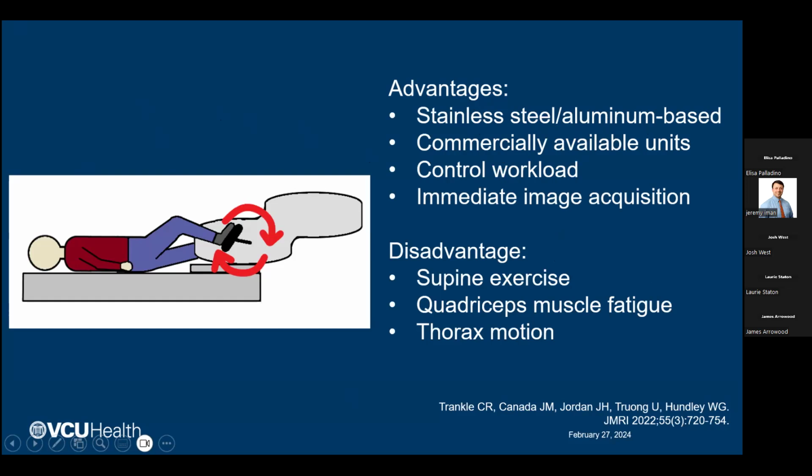It's very sophisticated equipment, but you can control the workload. And so, as with a bicycle unit that we might use in the exercise laboratory traditionally, if the patient pedals at a slightly faster cadence, the resistance eases off. If they slow down a little bit, the resistance goes up a little bit, so that you can prescribe the workload. If you say you want them to work at 50 watts, the machine will constantly adjust so that they're always achieving 50 watts, and then you can escalate it. You can have a ramping protocol, whatever you want to do.